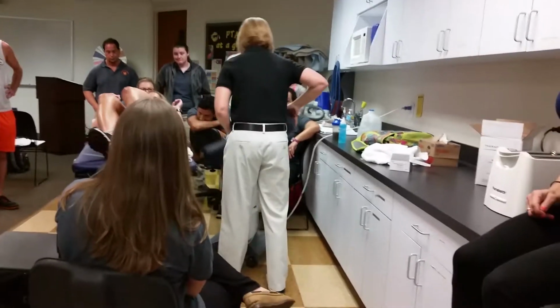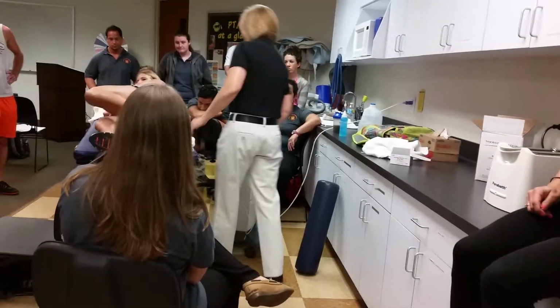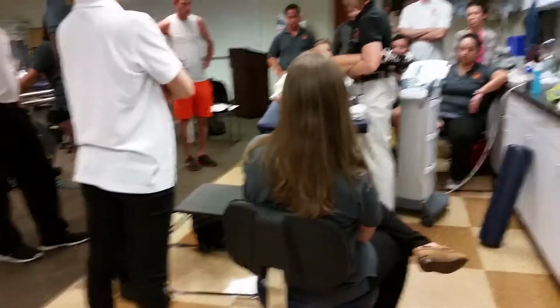I can have her on her side, and I can put pillows to help me support the leg, and I can kind of get her in this position, or I can use a little bench or something to hold her, and then I can do the ultrasound here. Or I can even hold her and do it, once I have it set up in this position. So I'm getting a stretch while I'm heating the tissues. As long as it's not hurting her. I don't want her in pain while I'm doing this for 9 minutes.